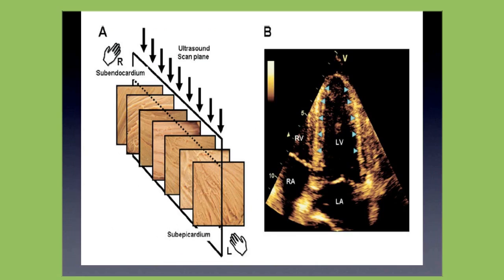It is very important that you recognize what is the location and where are the fibers that you're interested in interrogating. Longitudinal fibers are located in the subendocardium, while circumferential fibers are located in the mid-aspect of the thickness of the myocardium, and this is going to become important when we talk about the clinical applications. So, if you are trying to evaluate clinical processes that affect the subendocardium, like hypertension, diabetes, hyperlipidemia, coronary artery disease, obviously you could be interested in looking at global longitudinal strain.